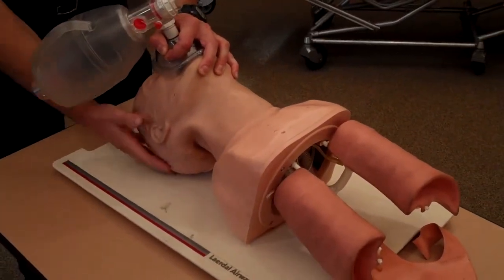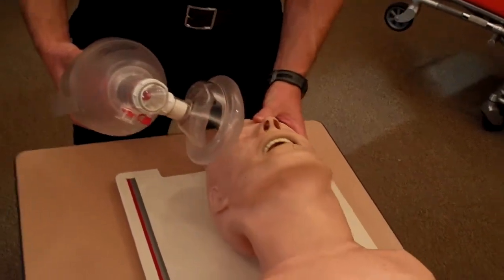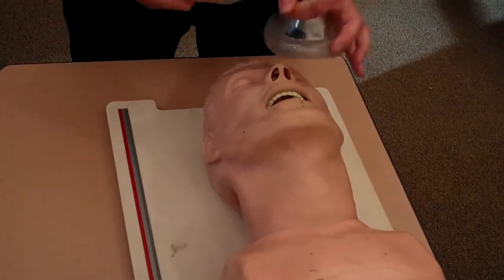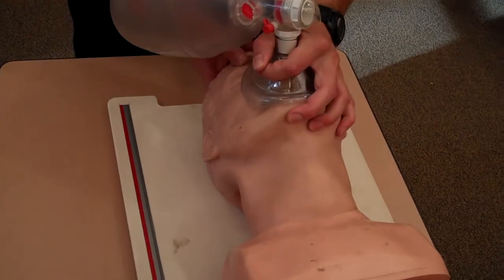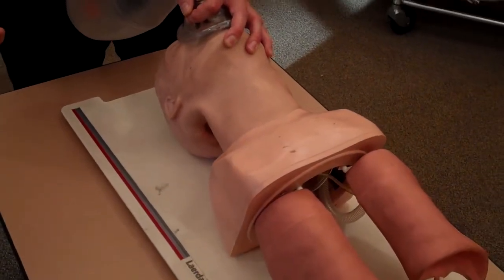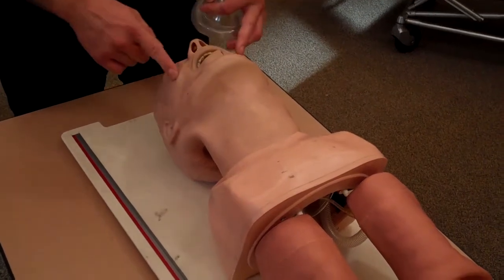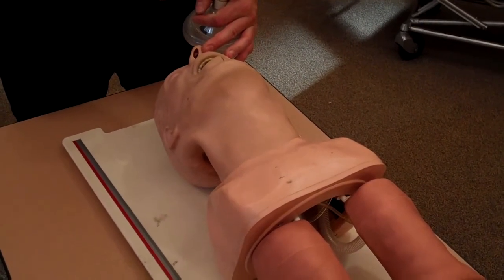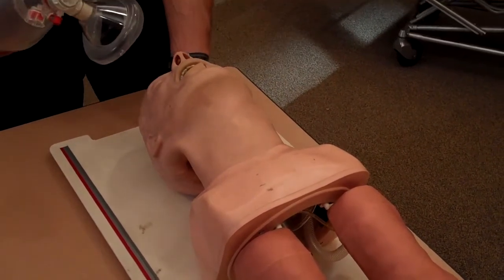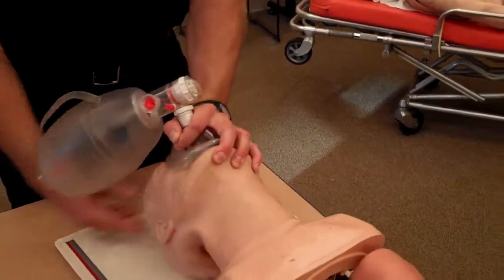In the classroom setting this works because everything's going in your favor, but when you've got a realistic patient that needs to be ventilated for a prolonged period of time, we recommend the OK technique. This will allow you to get a better mask seal and ventilate your patients better when they have difficult bag mask ventilation criteria like trauma to the airway, beard, dentures that are out, CHF, COPD, asthma, or anything else working against the EMT. That's the OK technique, and that's how we recommend ventilating patients.